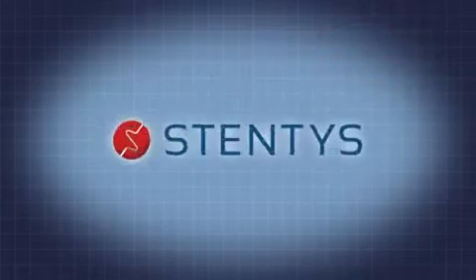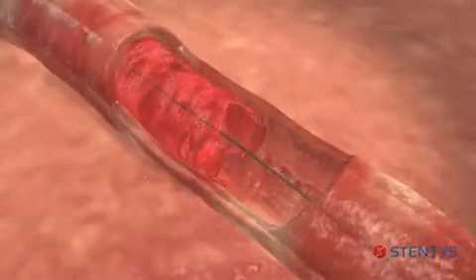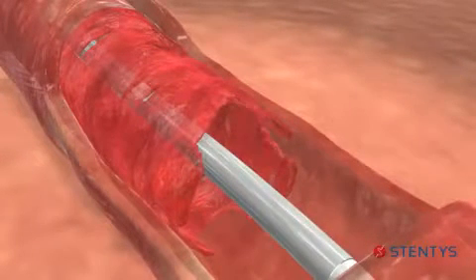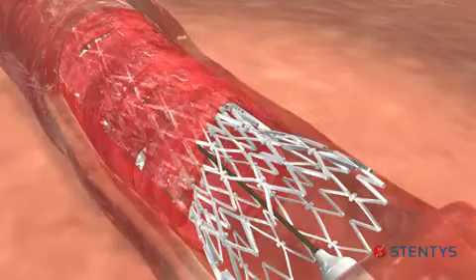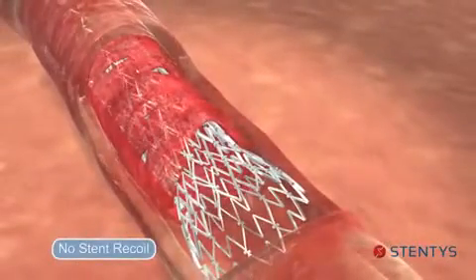Stentys is bringing a simple solution to the treatment of acute coronary syndrome. The Stentys platform is a self-expanding stent platform that builds on the superelastic properties of titanium alloy. It is gently and easily deployed over the thrombotic lesion by retracting a protective sheath, and because of its inherent design and properties, it exhibits no recoil.